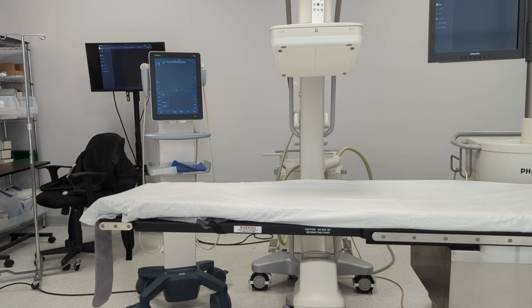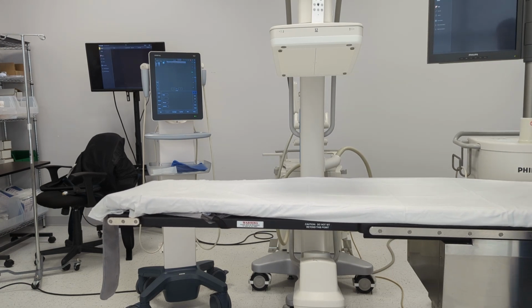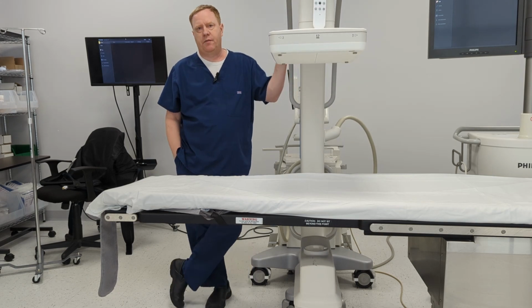And finally, I bring my screens in as close as I can so we can see the monitors. And I make sure that I leave plenty of room by test panning before I prep out. Alright, so that's how I use the C-arm in an outpatient lab.